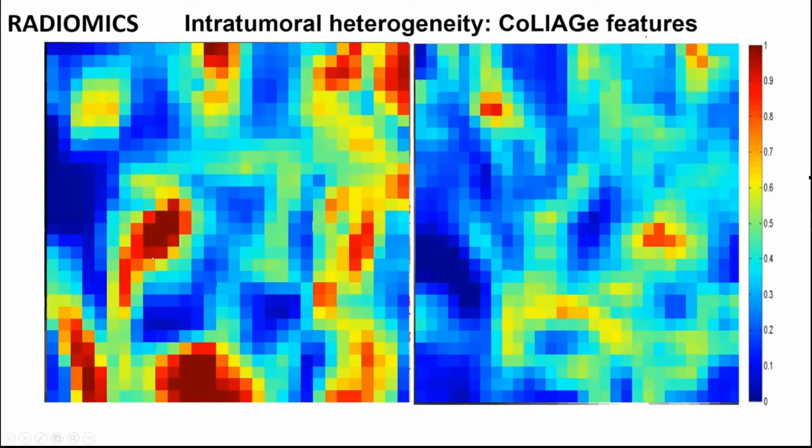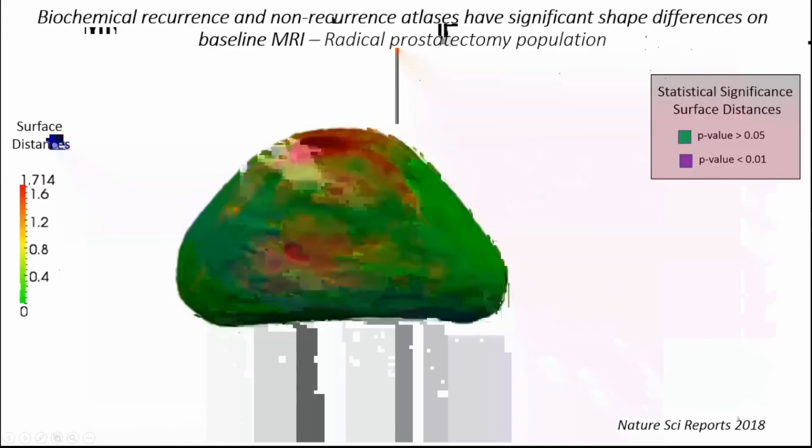So what you're seeing here, the reds essentially represent areas where you see high entropy, representing significantly high morphologic heterogeneity. The blues represent areas where you've got relatively low heterogeneity, more homogeneity. And so really no surprise that the cancer turns out to have high entropy, high heterogeneity. Radiation necrosis tends to have much lower heterogeneity. Even though these differences weren't obvious on the original MRI scan, by switching it over to this entropy map, the differences become more apparent, and we now potentially have the ability to obviate the need for intracranial biopsies in patients who have radiation necrosis.